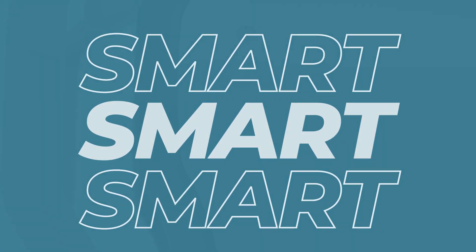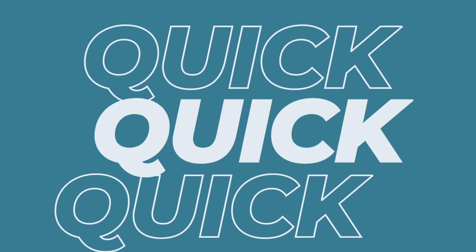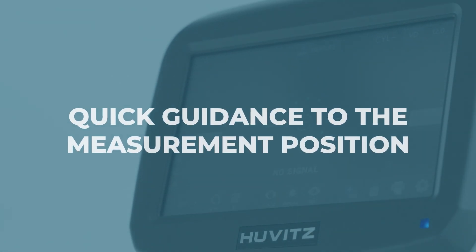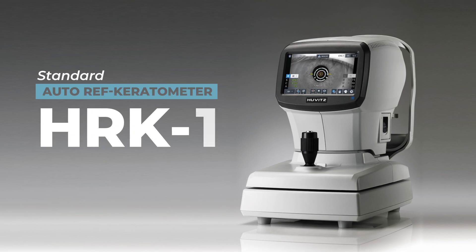Accurately measures vision with smart assembly moving control technology and quickly guides the center of the cornea. HRK1, standard autorefractometer keratometer.